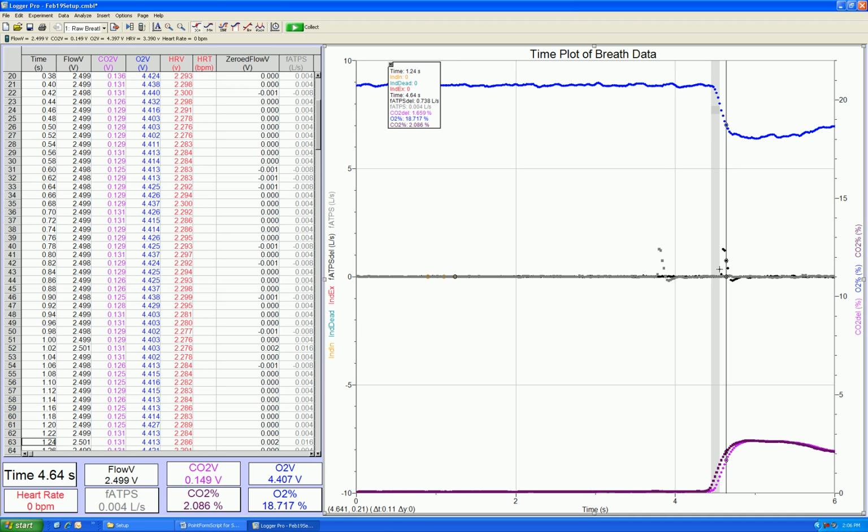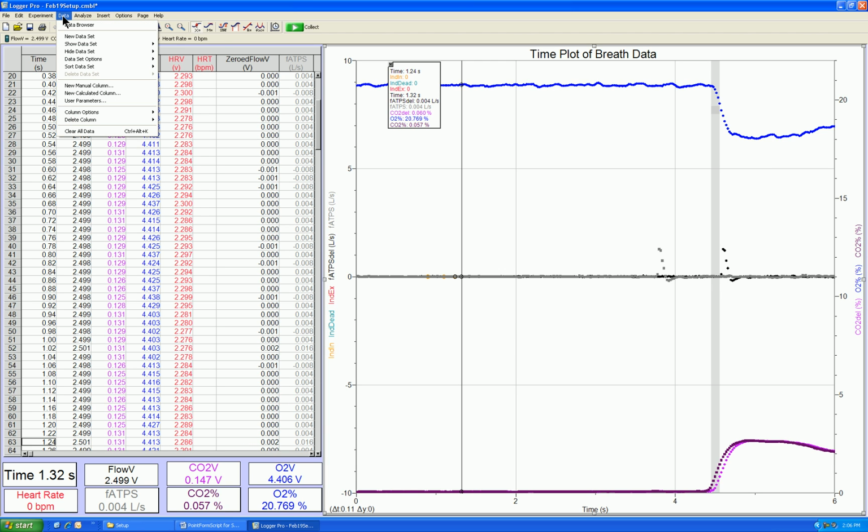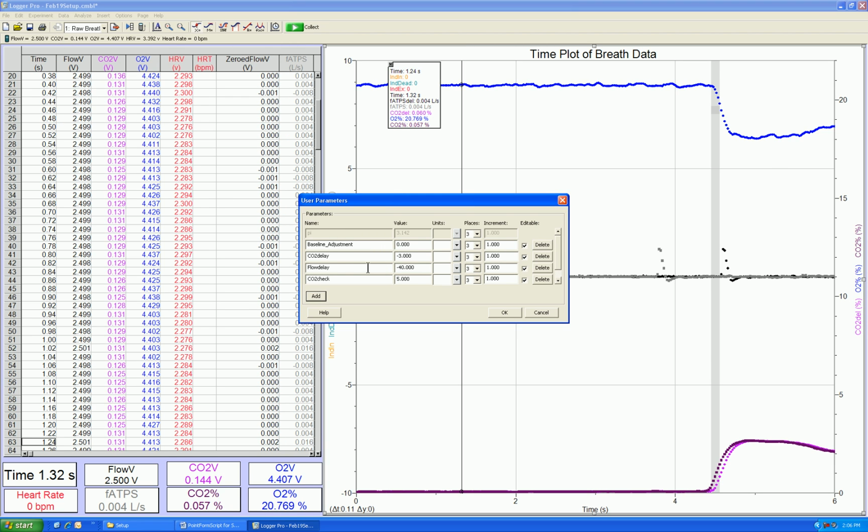So this total delay has been determined, as I said earlier, with a gas pulse at Qubit and entered into the calculations. You can see this delay. It was entered as a parameter which you can observe under the data menu, and if these values have changed significantly, you can change them to match your new signal alignment.